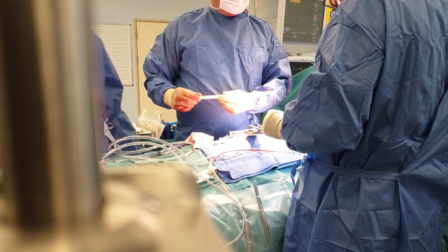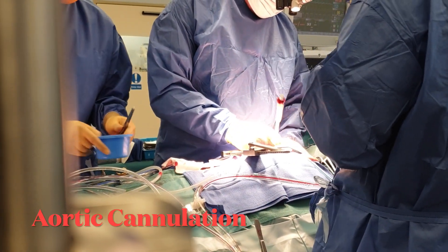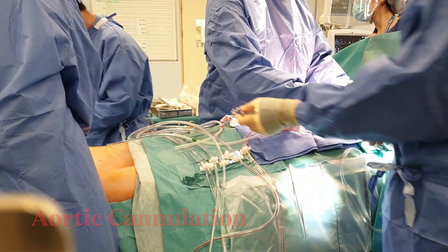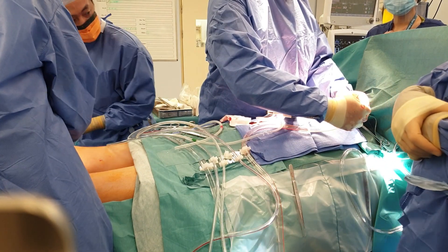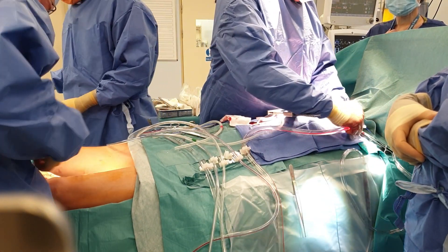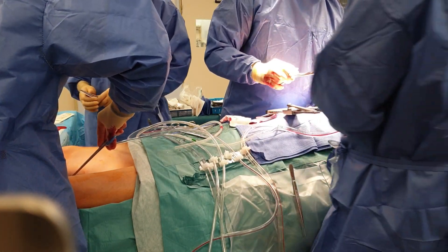The surgeon places a cannula, a specialized piece of tubing, into the patient's aorta and the right atrium. The patient's blood is then drawn through a tube into a reservoir. A pump is used to pump the blood from the reservoir into the oxygenator, where oxygen is added and carbon dioxide is removed.